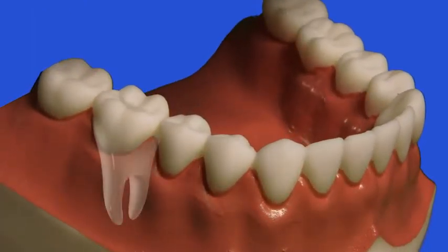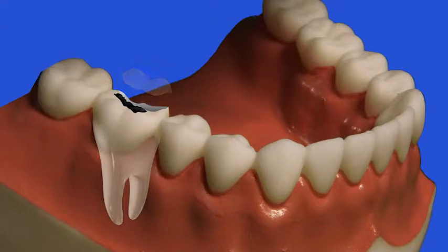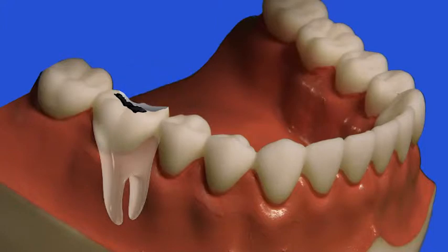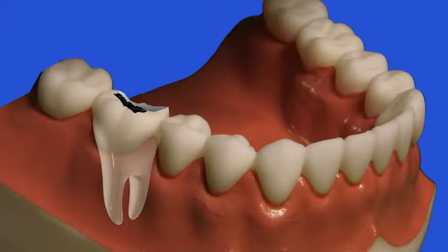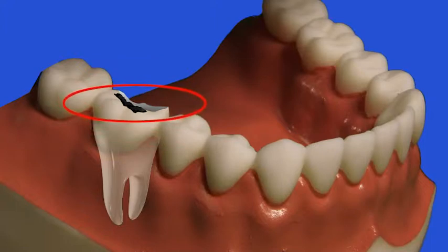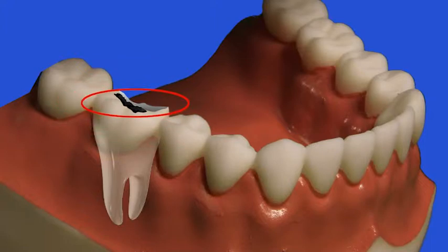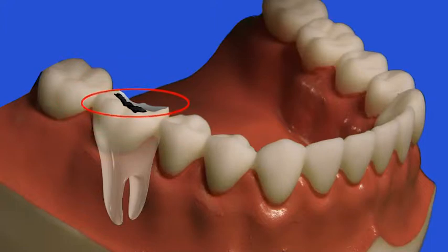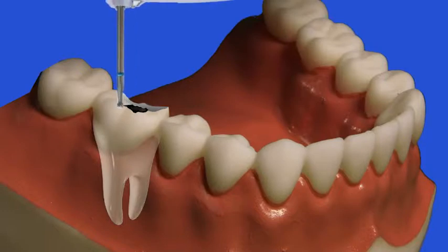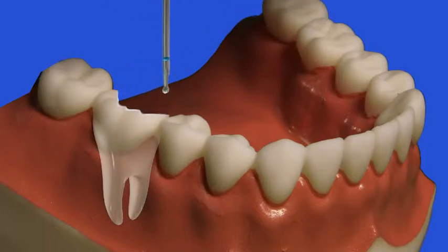Here, a cusp fracture that occurred above the gum line is restored with a crown. Cusp fractures may occur in teeth that contain old fillings, or they may be the result of bite problems or injuries. The dark area here denotes an old filling. The dentist will remove the old filling and damaged or decayed tooth material around the fracture.